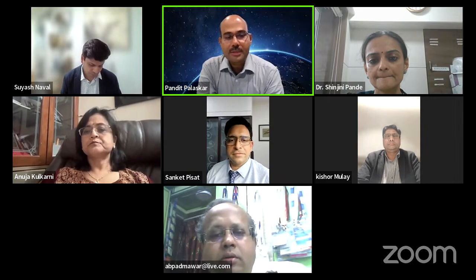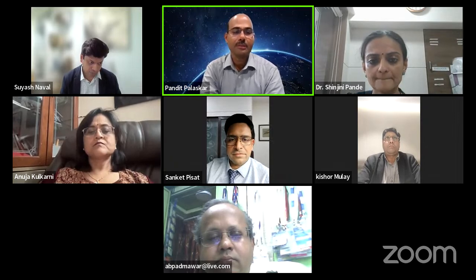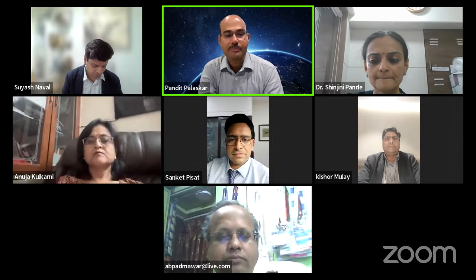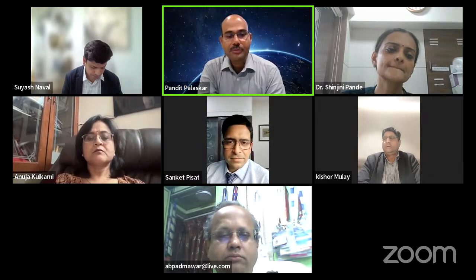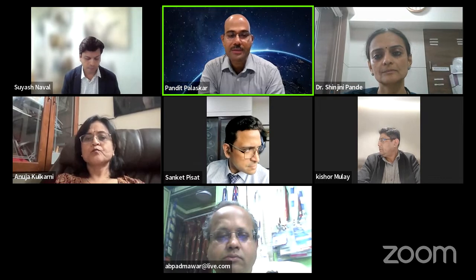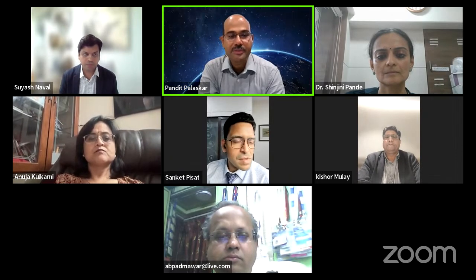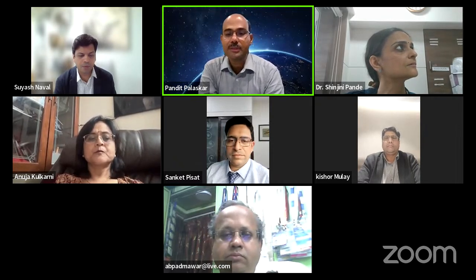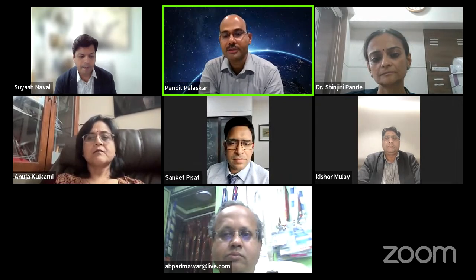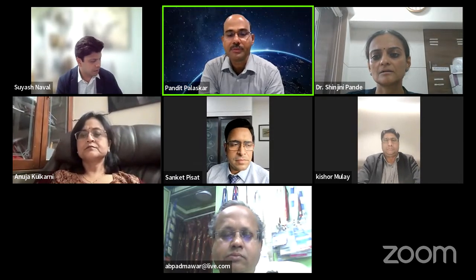Friends, as Ameya has said, after the imaging system for endoscopy, we need two very important tools. One is a very good camera system, and the other is very good energy sources. Energy sources play a very important role in the better outcome of endoscopic surgery. If you have a very good energy source and use it wisely, the outcome will be very nice. If you don't have a good energy source, or don't use it in the proper way, you land in complications, because most of the complications, whether it is ureteric injury, bladder injury, fistulas, intestinal injury, or delayed intestinal injuries, are caused by the improper use or lateral spread of the energy from the energy sources.